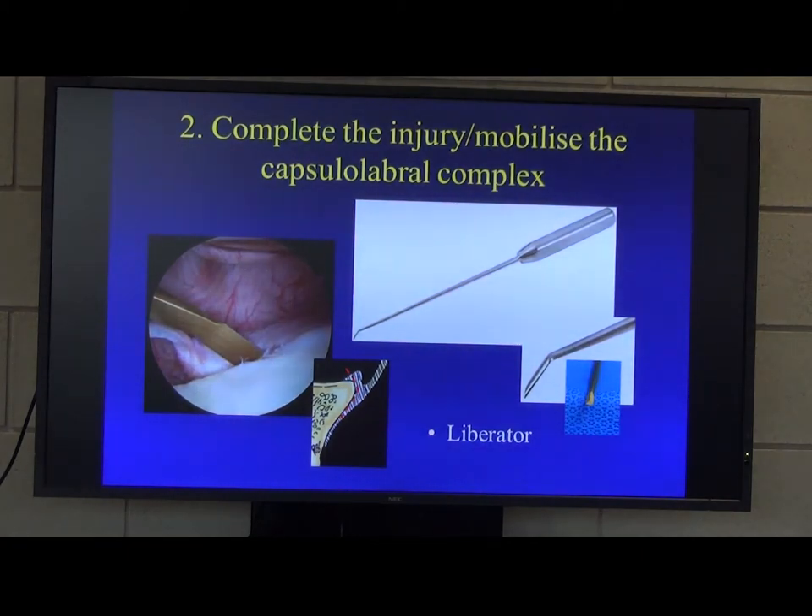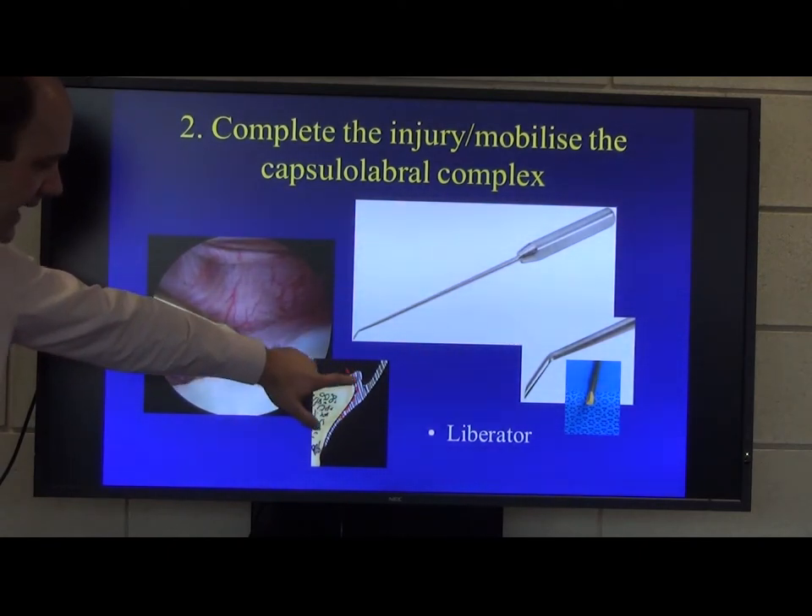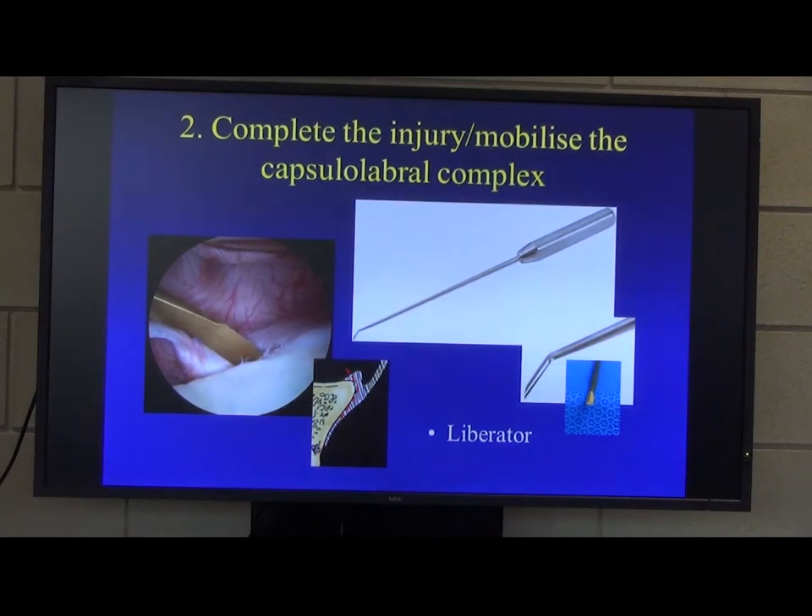The next stage, once you've got your cannula and portal in, is to actually complete the injury. When the labrum gets pulled off the anterior glenoid, it doesn't get pulled off in entirety — there are still strands connected to the glenoid neck. So you actually want to completely release all that, so you can fully mobilise the capsule-labrum complex and position it. You want to come in just between the articular surface and the glenoid and along the neck, taking the labrum and capsule off as a single entity.